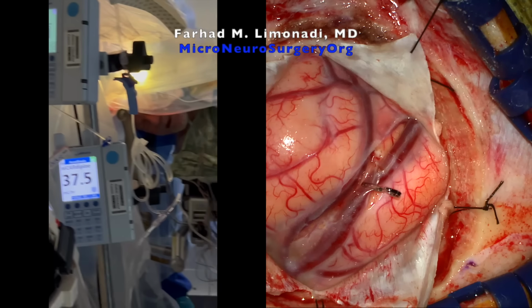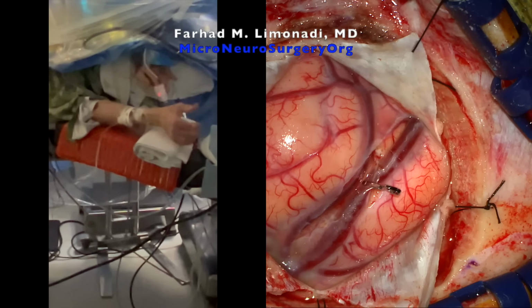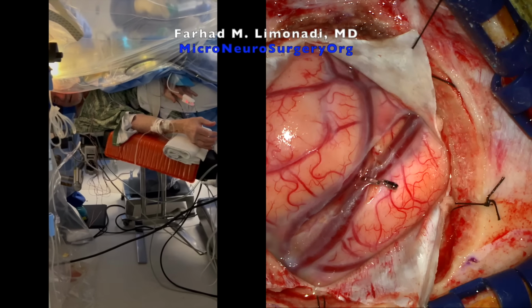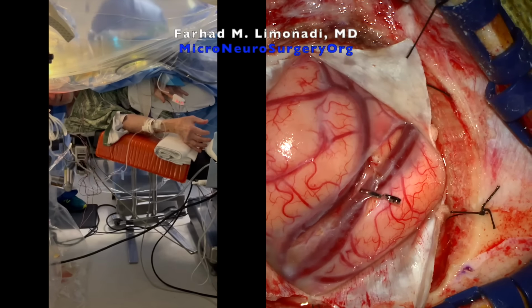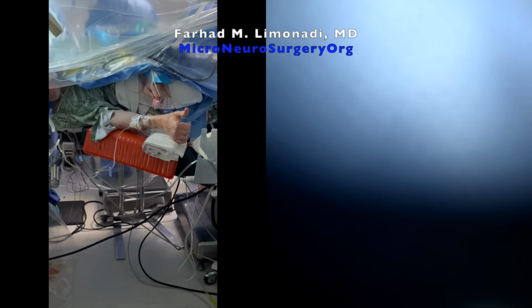I can't quite move it. Open and close your hand. You're doing great. Both of them? You got it. There you go. Do you have the other clip? The operating room is wide awake. Now, can you open and close your hand? You're doing so well.